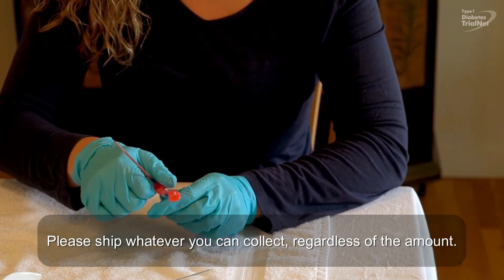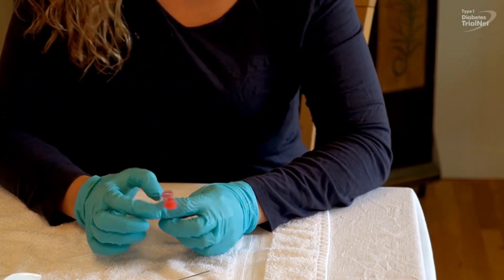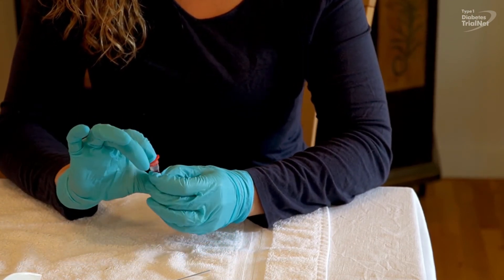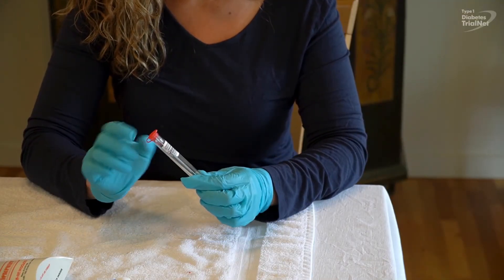If you are using the straw, twist and remove it with its top and discard. Carefully close the tube with the attached cap and gently invert 8 to 10 times. Place the collection tube into the barcoded test tube holder.